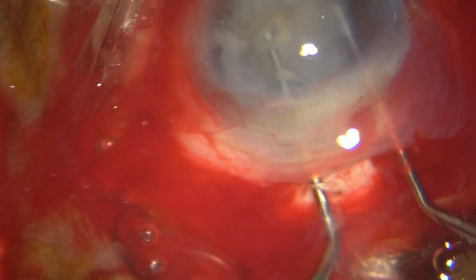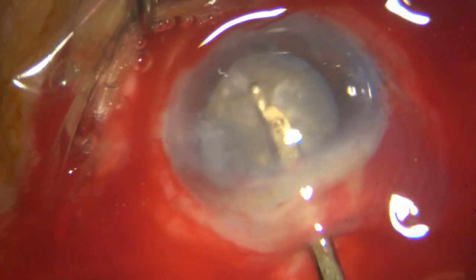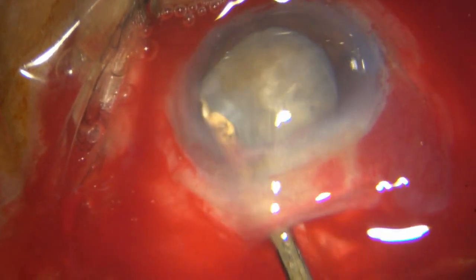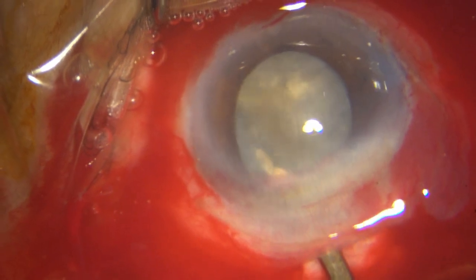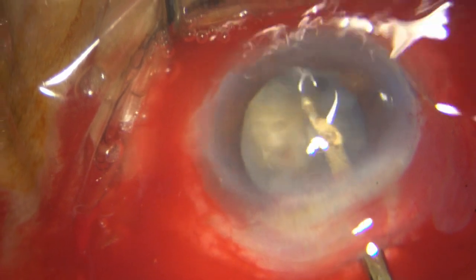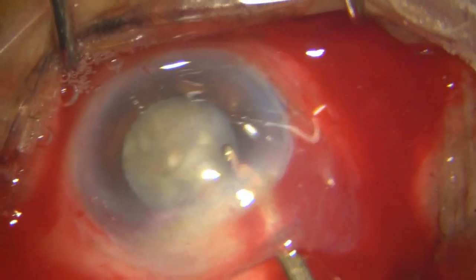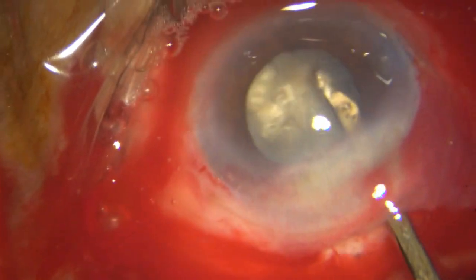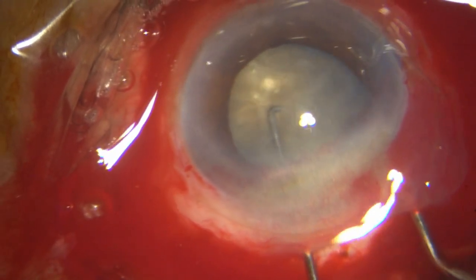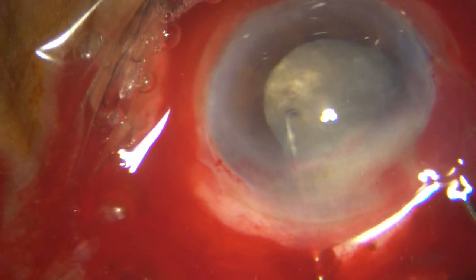So I don't want to forcibly go in, because I have no idea of the integrity of these zonules. This is such an advanced cataract. You have to be very careful. Don't make it worse than it already is. So I just aspirate. You can see the block is not good. So she is obviously in little discomfort, but she is so old and she is trying her best to cooperate, and I really appreciate that in her. Again I try and decide, no, this is too blind a procedure.